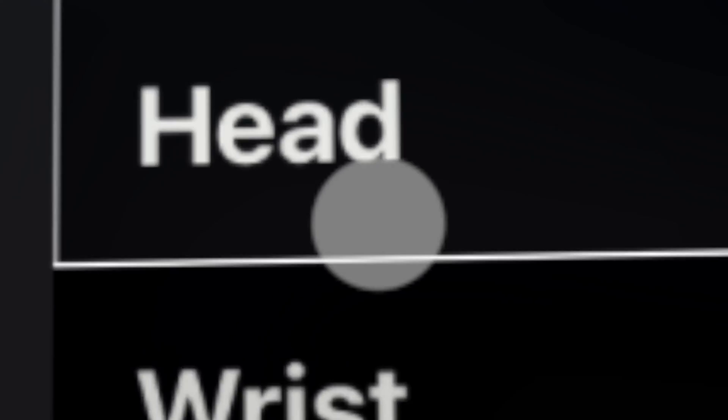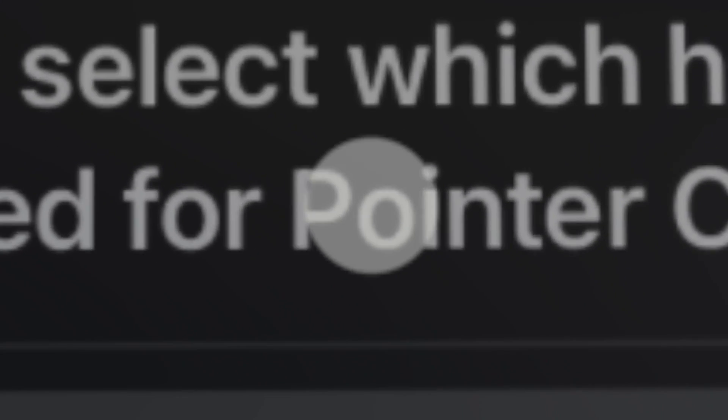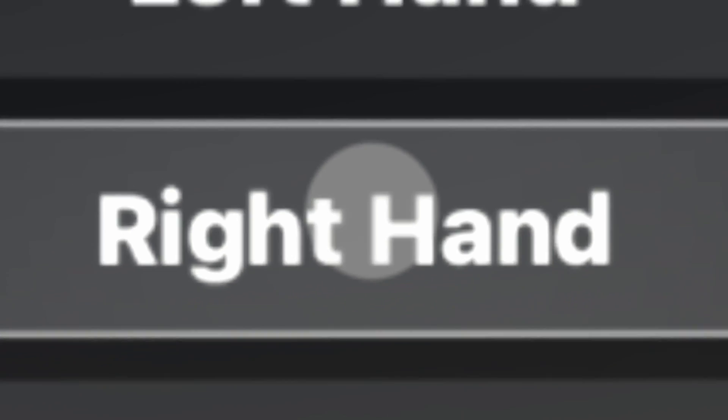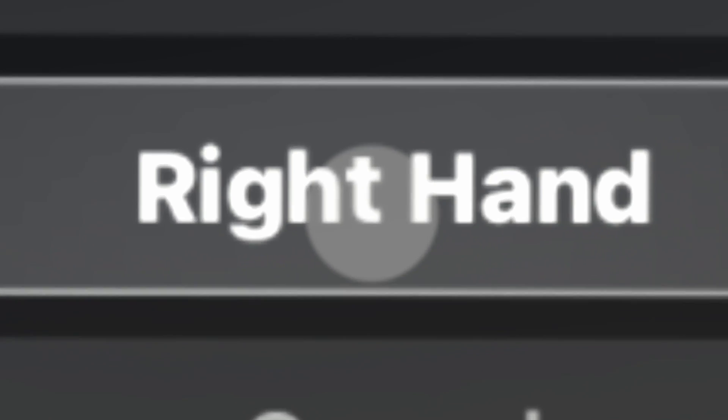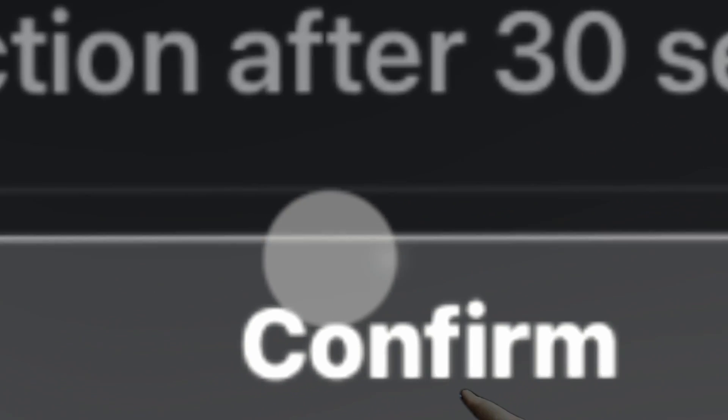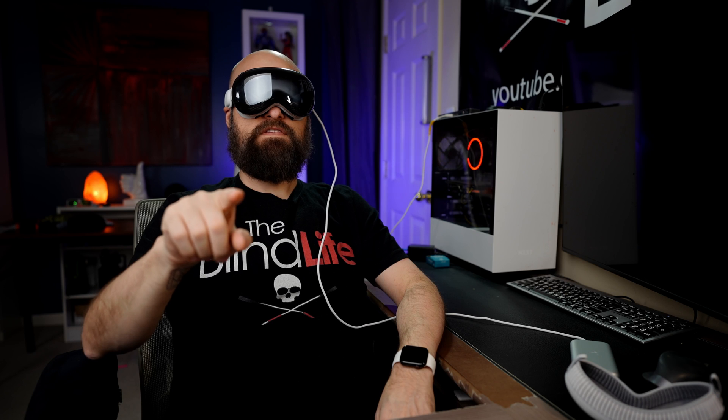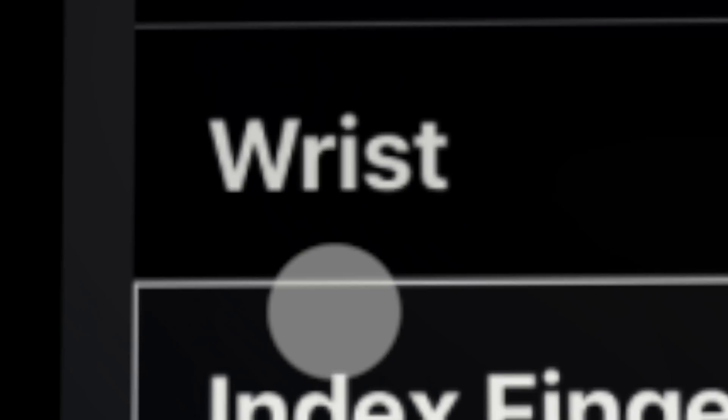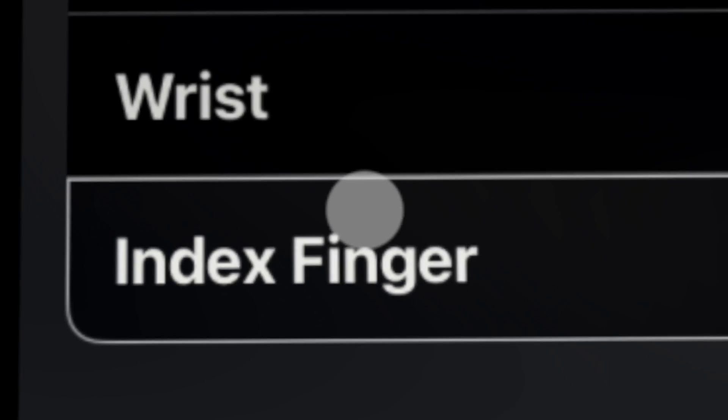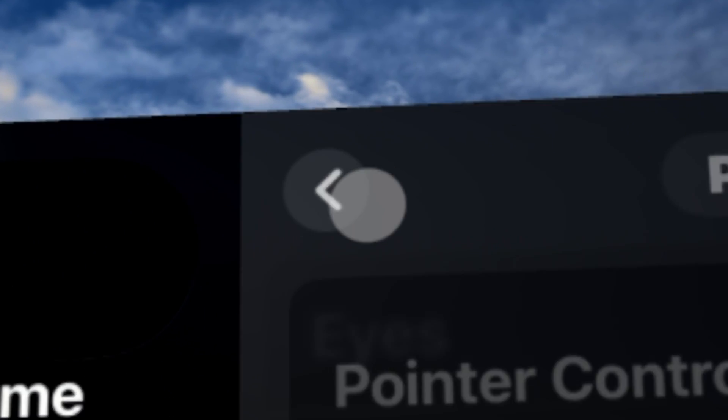I have pointer control turned on, and I have the control set to head. You can set it to eyes, head, wrist, or index finger. So set it to index finger. And you choose which hand here. I'm going to choose right hand. And continue. Now as I point, if I want to choose something, it's a little tricky to do, especially zoomed in. But you can point with your index finger here. Set it back to head.